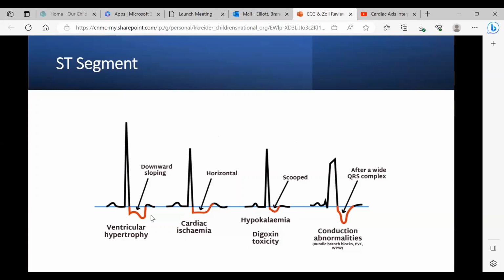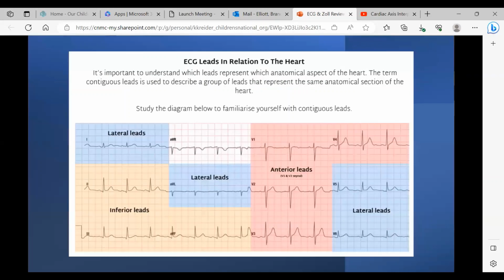So in the example I'm showing you, the 12 lead may not necessarily recognize the previous ischemia, may say undetermined, but it will try to pick up the elevation and depression when it goes to read the information for you.